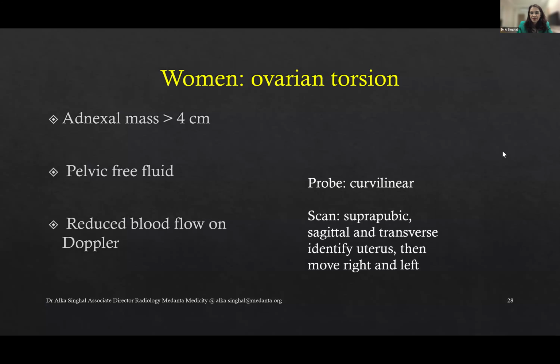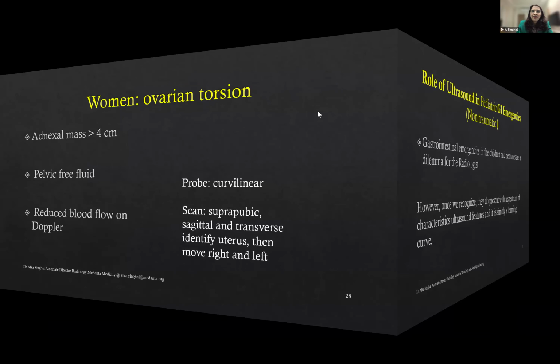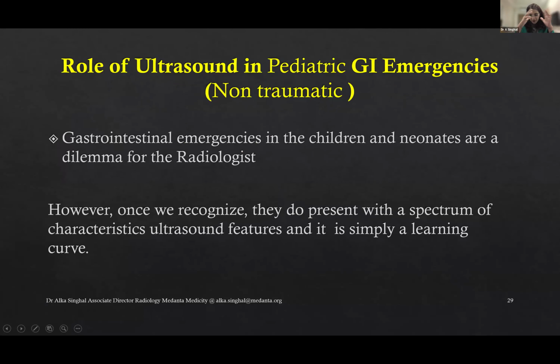Okay, so next we go to, right. So having this overall perspective, right? Now, acute abdomen, as we know, there's a lot. So in adults, I would say, you see pancreatitis, you see renal calculi, you see gallstones, you see perforation, fluid, you can see mesenteric ischemia, you can see thrombosis.